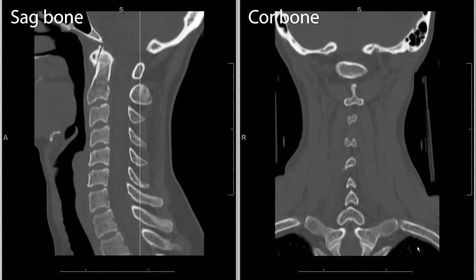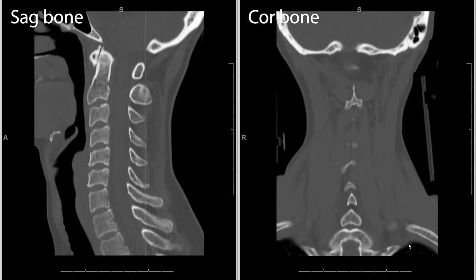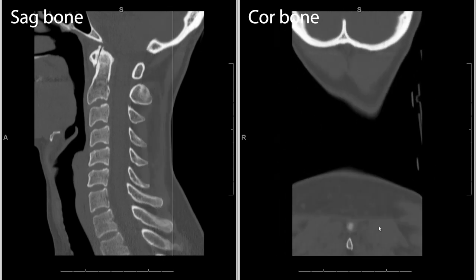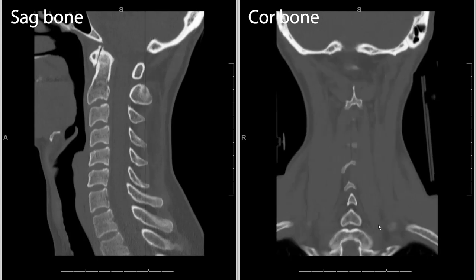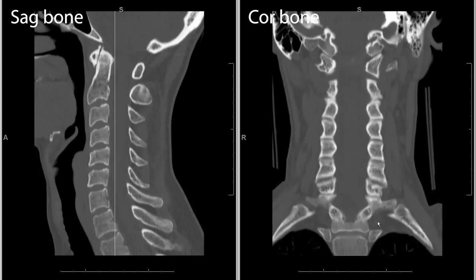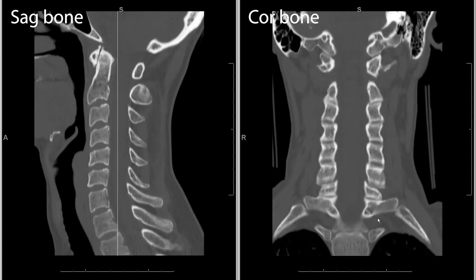After looking at the sagittal and coronal images we can feel pretty comfortable that this is a relatively normal patient. We don't have any big displaced fractures, and we sort of have that in mind before we move on to our axial images.